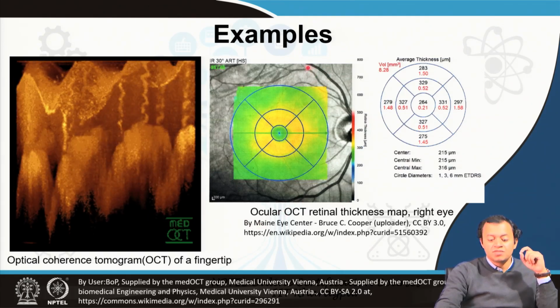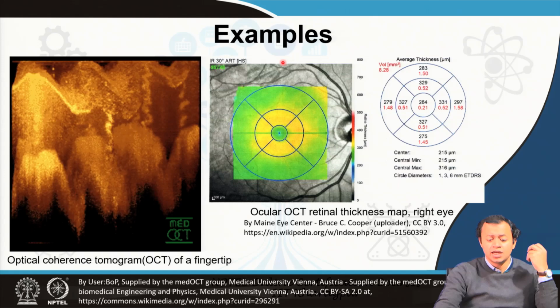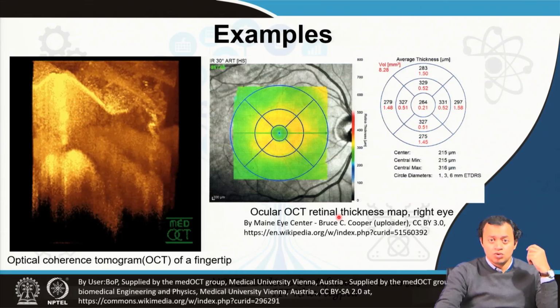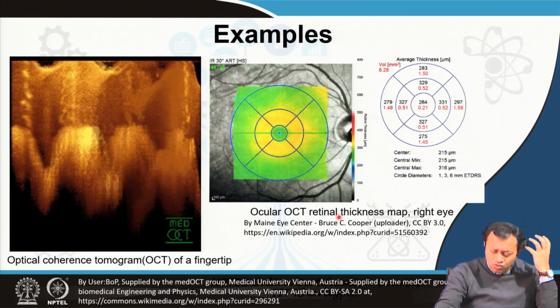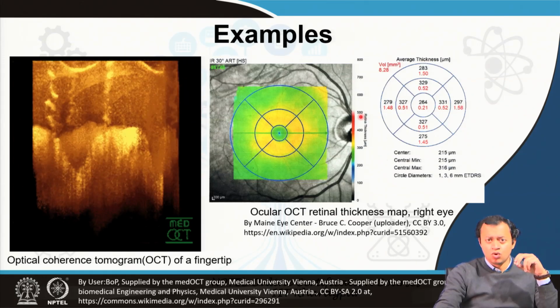Optical coherence tomography has been one of the most stable and one of the most reliable techniques to look inside your eyes and figure out the ocular retinal thickness. So, anyone who has some kind of retinal damage, or some kind of an eye based problem, several ophthalmologists who are watching this video can corroborate me.